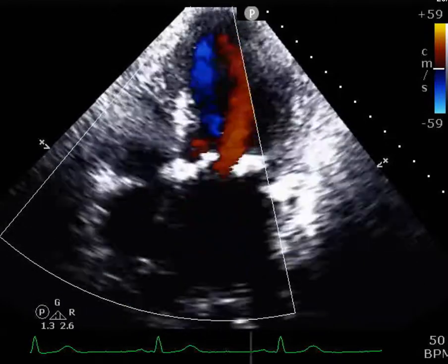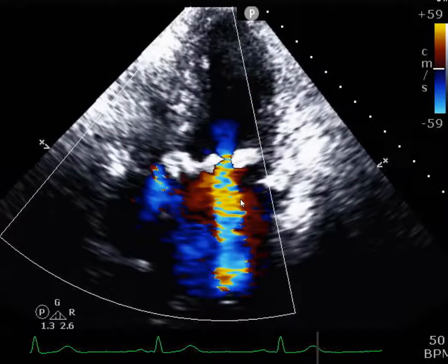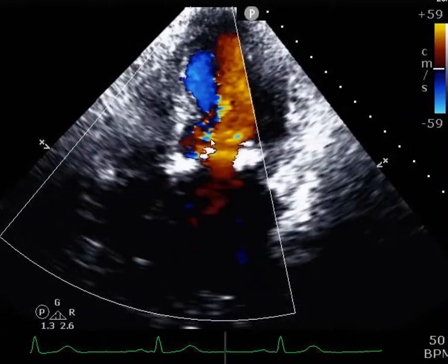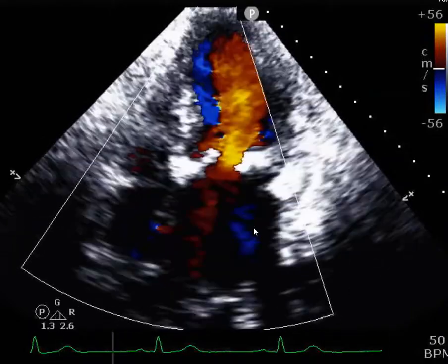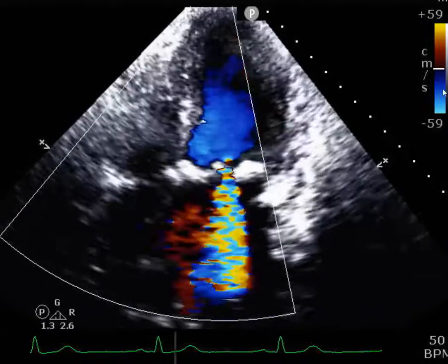And here is a very impressive mitral regurgitation view, jet. One of the things I always teach the fellows is to look at your Nyquist limit. Here we have a pretty big color window. You see the jet pretty well, but whenever you have a big color window, you run the risk of having your machine automatically turn your Nyquist limit pretty low.